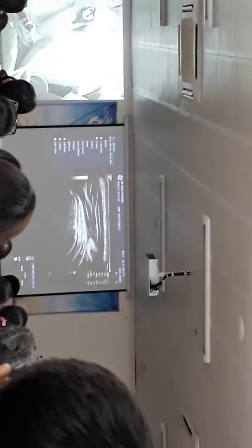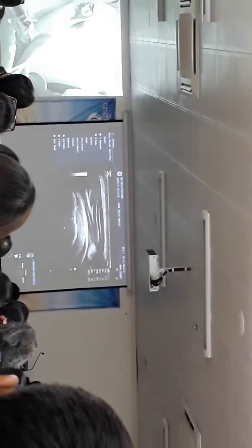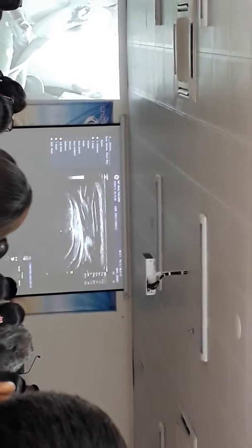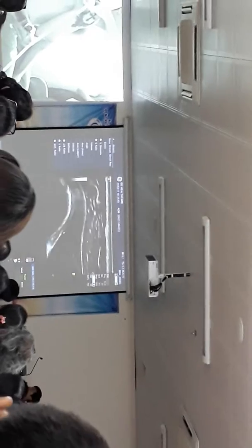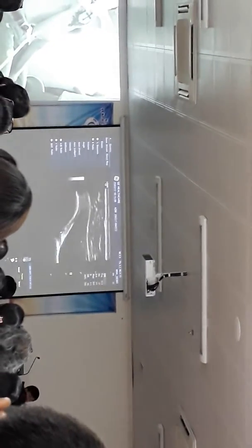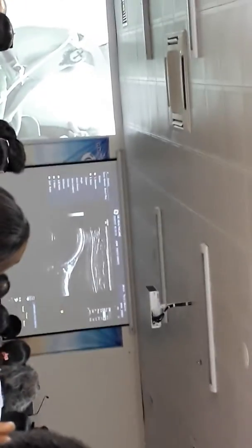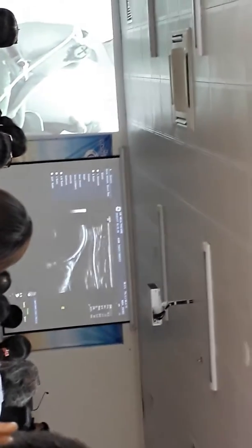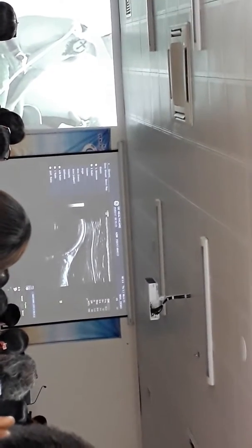because this is where we will see our Hill-Sachs deformity in the posterior humerus after dislocations. To look at the posterior joint, we just rotate more posteriorly. We decrease our frequency to increase the depth. So this is the plane that we're after to look at the posterior capsule.